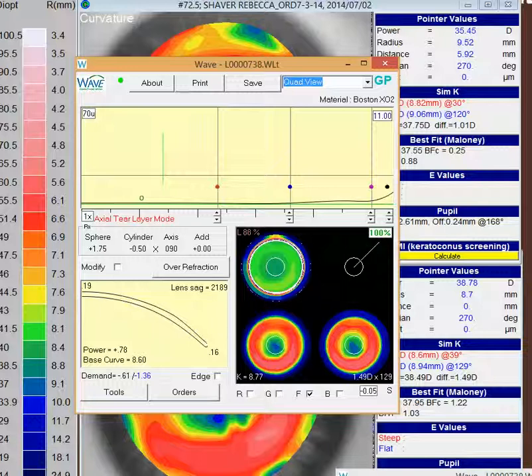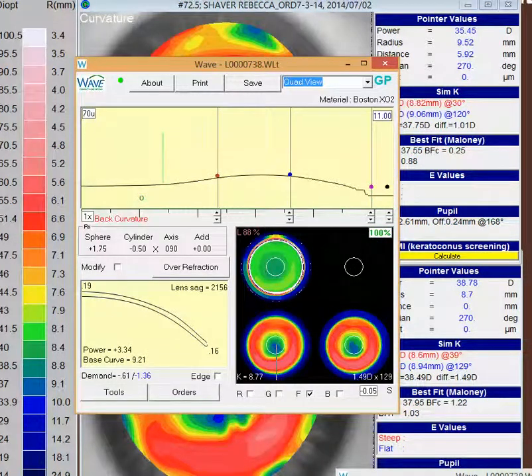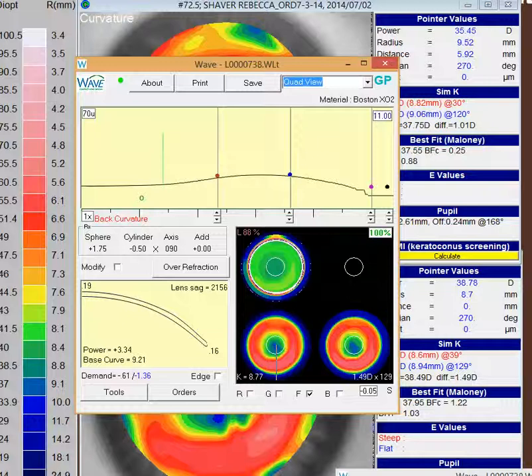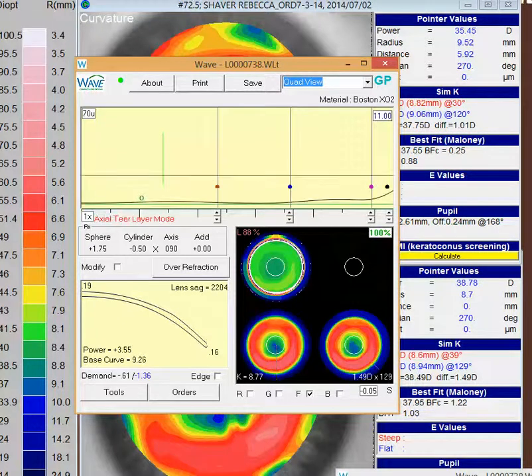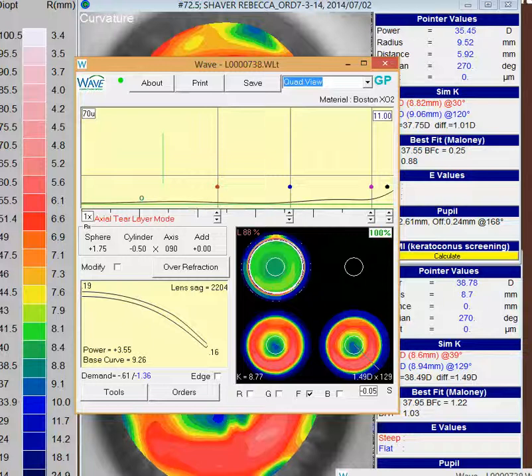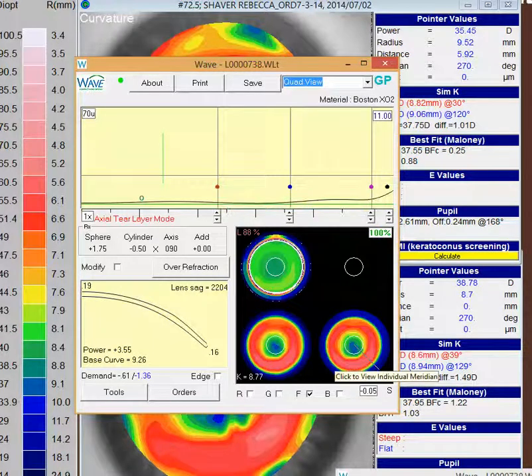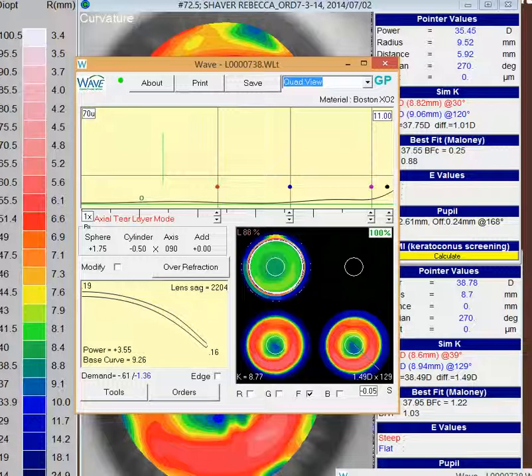In this particular example, what I did is I set the red dot probably on the inside ring of that zone somewhere around 4.6, 4.7, and then the blue dot out around the outer edge of that red zone.